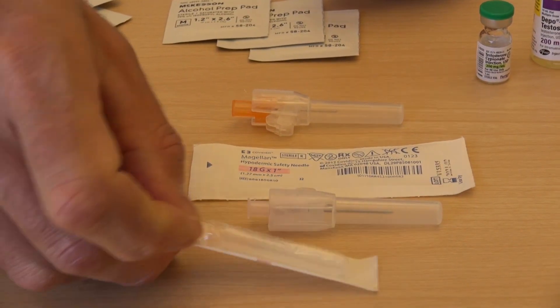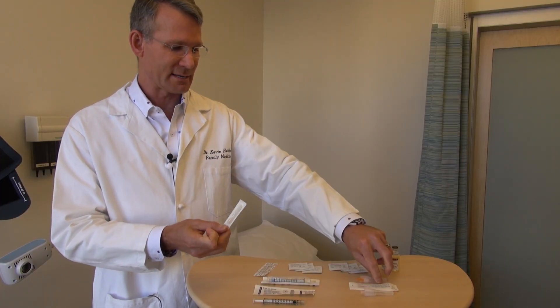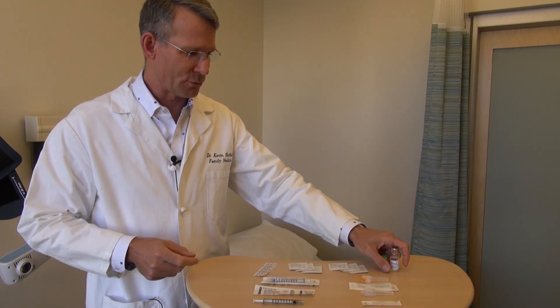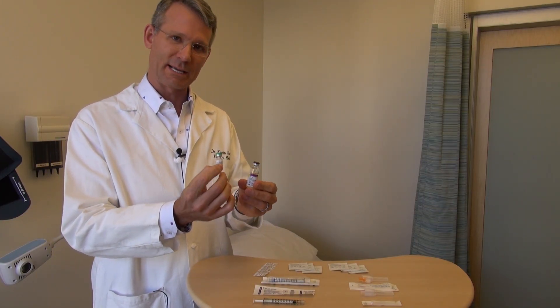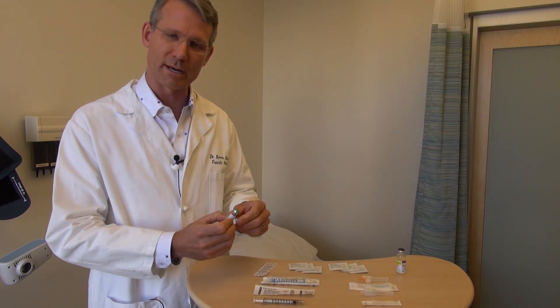When you get your needles from the pharmacy they'll be wrapped in a little bit of paper and will be much smaller in appearance — you can see the difference in size between the two. And of course we have the testosterone over here. For today's injection we're going to be drawing it up with this very tiny bottle, and this is what we're going to be using, so that's here on the table ready to go.